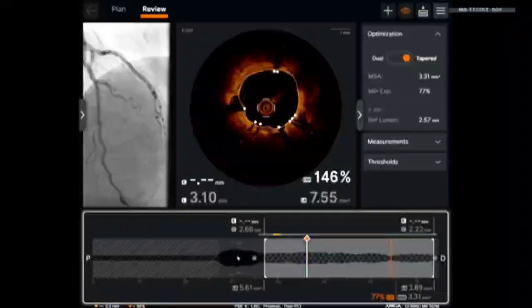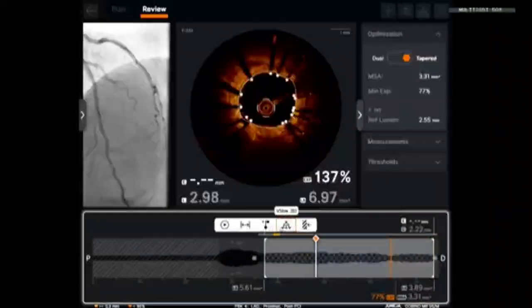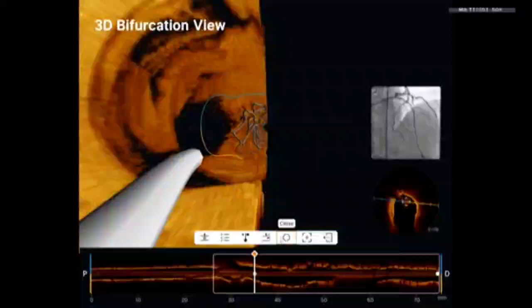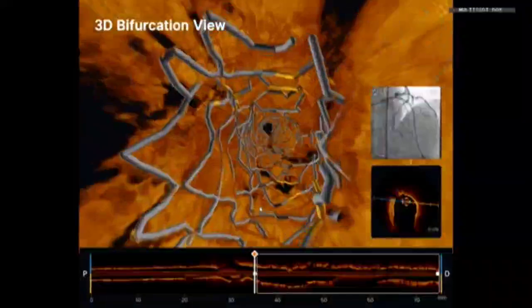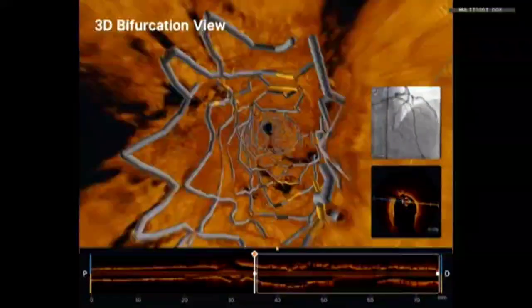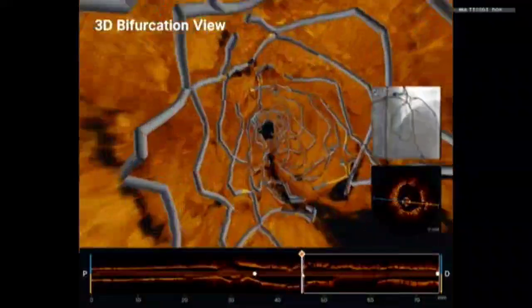You know, we are going to dilate with Dr. Kapoor. Can we go to 3D bifurcation mode? 3D bifurcation. Yeah, we are showing to you, Goran. Yeah, look at this. This is definitely precise placement, right, Goran? What do you think? This is super precise. Okay. I thought he would be back at least one stent strut into the left main, but actually he proved me wrong. Dr. Kapoor, congratulations. This is really a masterpiece of work.